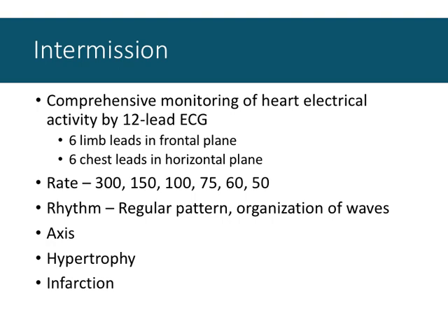So I'm going to break there. We have technically 10 minutes left in class, but I'm going to break there because we're at a really nice break point in the middle of our discussion. We move from rhythm to axis, hypertrophy, infarction. The last three are really nice, clear, ordered, easy to diagnose characteristics. Not like rhythm, which is today's more creative, qualitative, out there interpretation. There's some loose interpretation that you can make with rhythm. Diagnosing rhythm isn't always so easy.